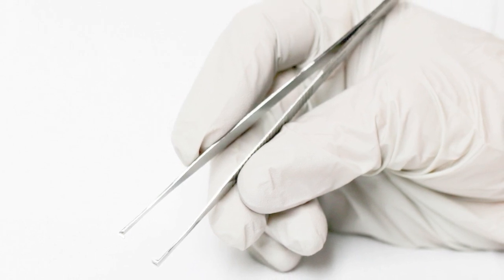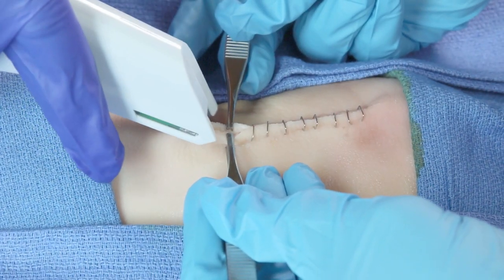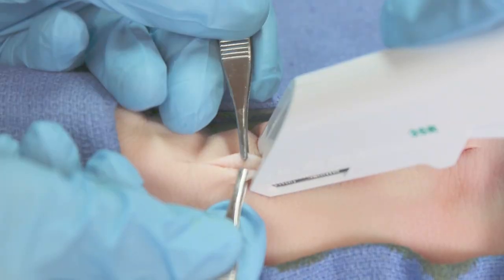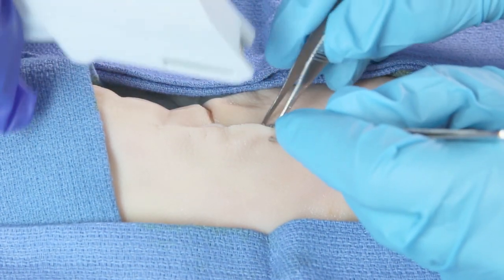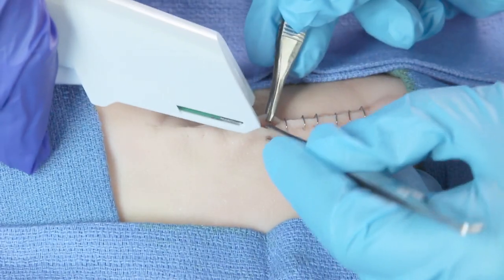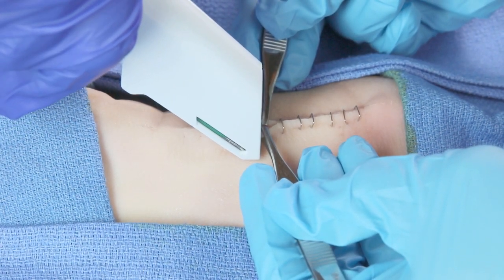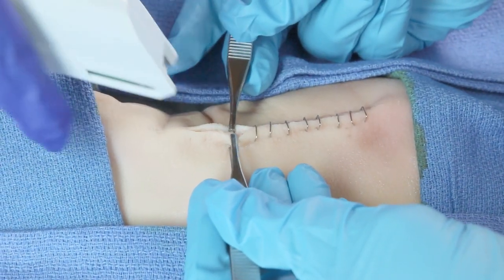Your partner — we'll call him or her the surgeon — will hold the stapler gun in their hand like you might hold a garden hose nozzle. They'll stand in a position so that there's an overhead view of the laceration to be closed. The assistant then grabs the edges of the skin closest to you with the two forceps, then he or she will evert the edges — that is, turn them inside out slightly — and hold them together, so you're everting the skin a little bit. Hold your stapler at a 60-degree angle or so to the approximated skin edges and press firmly downward, right in back of the Adson forceps.